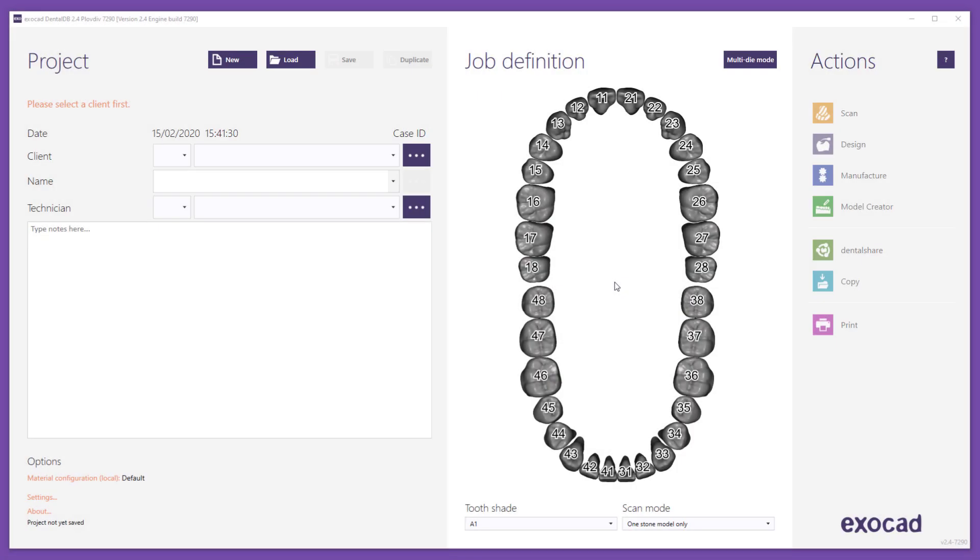This video tutorial from ExoCAD will show you how to set up a DentalShare account to transfer project data between different users.